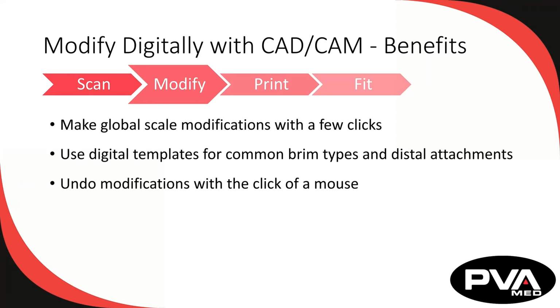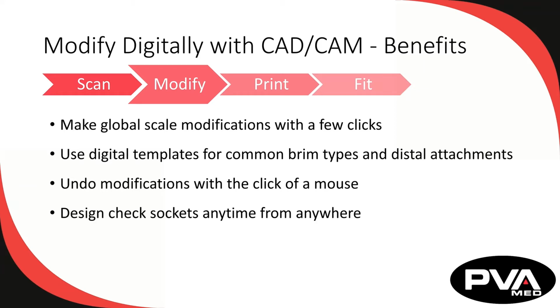Word processors were definitely a typewriter killer. Another benefit is that digital modifications can be performed on a computer anytime from anywhere there's an internet connection. No need to pour, mix, or wait for plaster to dry. The implications of this benefit are profound and appropriate for today's socially distanced work environments.